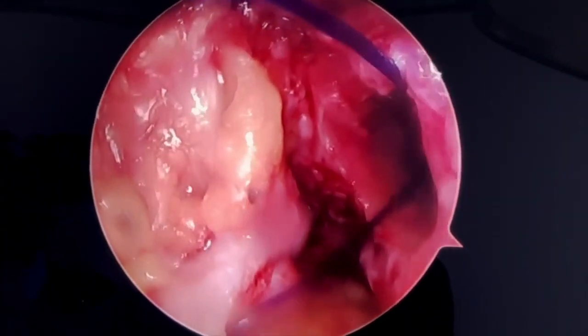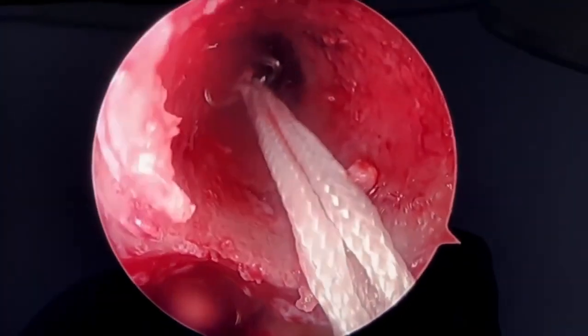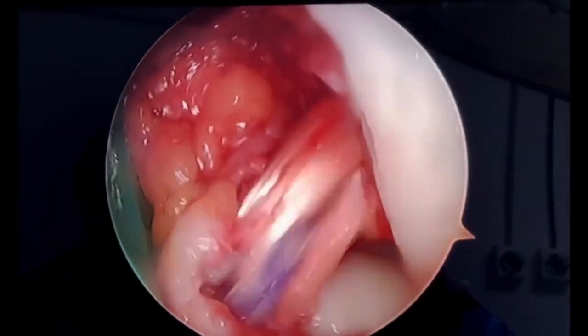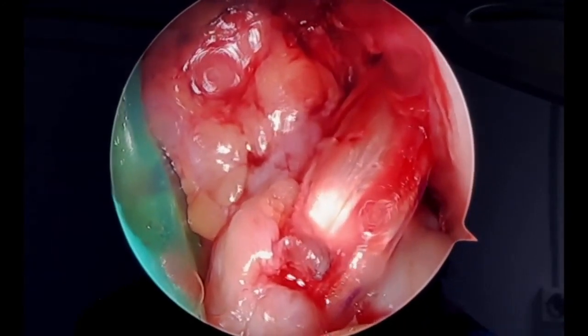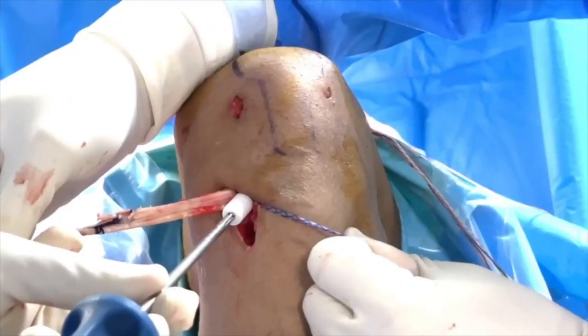The tightrope and graft are passed through the tibial and femoral tunnels using a passing suture. The tightrope is tightened until the proximal 2 cm mark of the graft reaches approximately the inside of the femoral tunnel. The knee is then placed in 90 degrees of flexion, and the ACL graft is secured with a bioresorbable interference screw whose width and length are determined according to the size of the ACL graft and the length of the tibial tunnel.